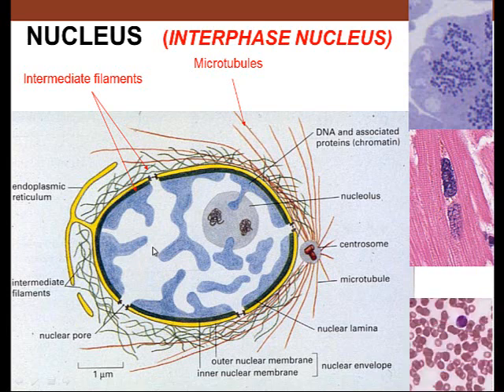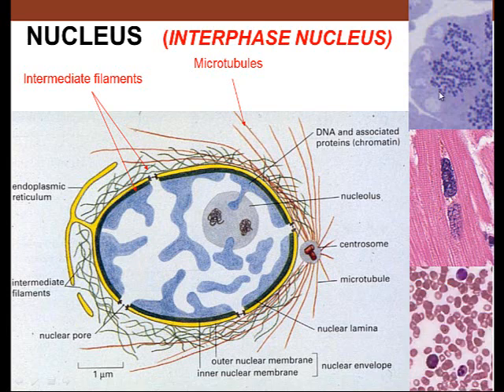If we look at these different cells, here's one cell, a pyramid type cell. You see euchromatin, lighter chromatin in this cell, and there are secretory granules in this particular cell. This is the base and this is the apex.